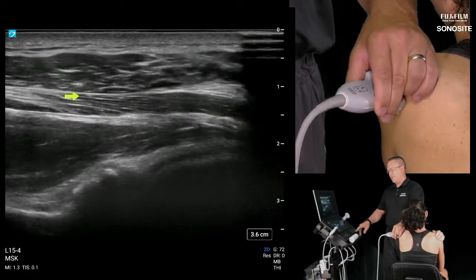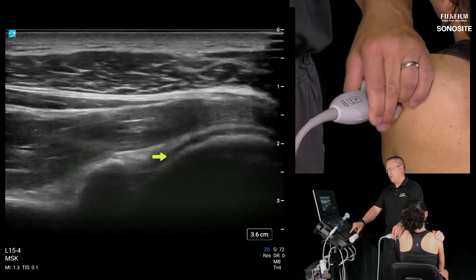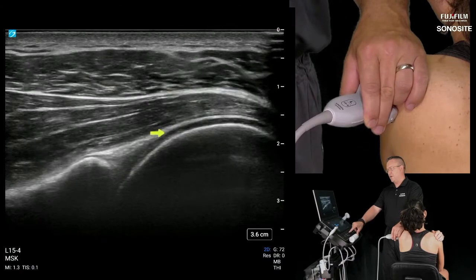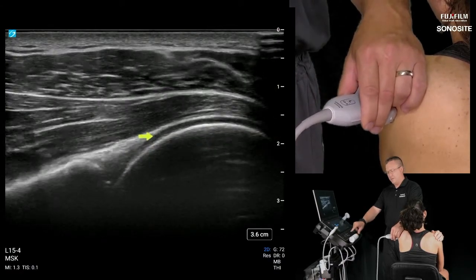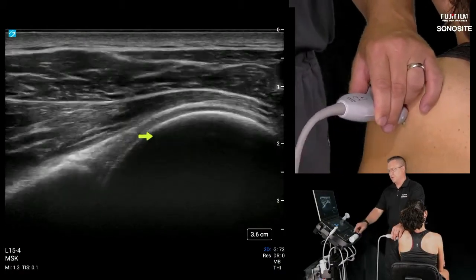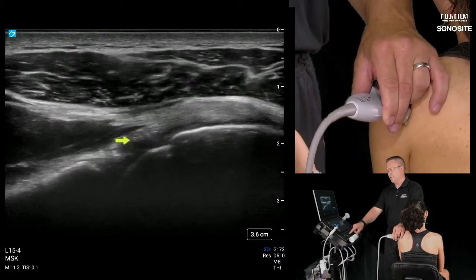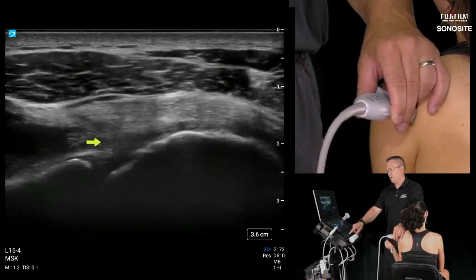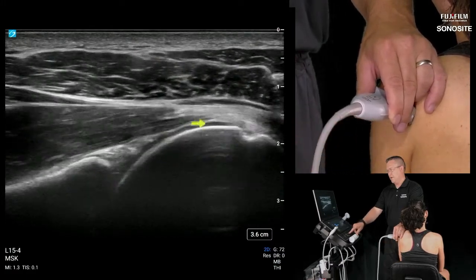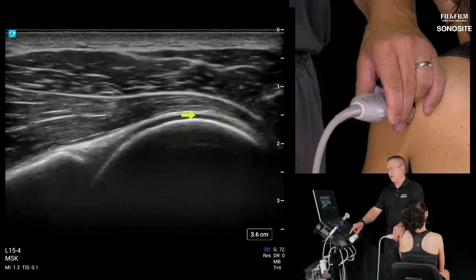So counting our layers underneath here, we've got glenoid, humeral head, here's that posterior labrum, and then let's watch this joint capsule under the infraspinatus kind of unfold itself. I'm going to keep our patient's elbow down to her side here, and then she's just going to slowly externally rotate, and let's watch this joint capsule unfold. Here we go, right there. And then let's internally rotate. Okay, and then it's folded and tightening over the articular hyaline cartilage of the humerus.